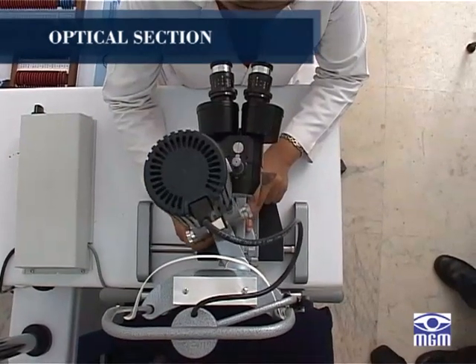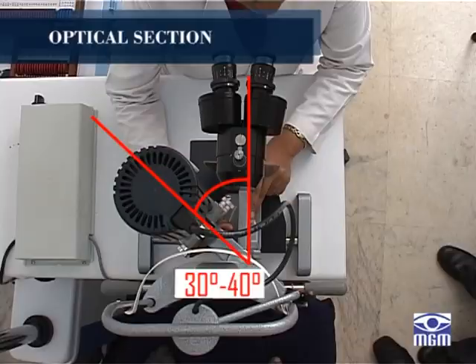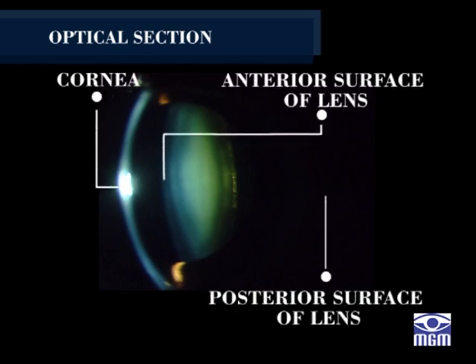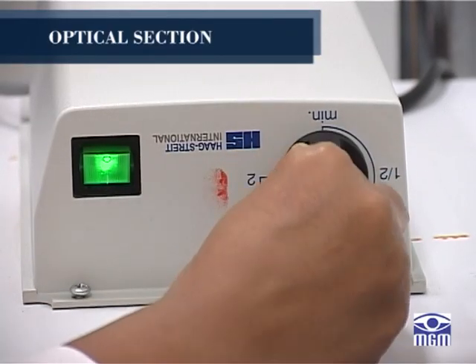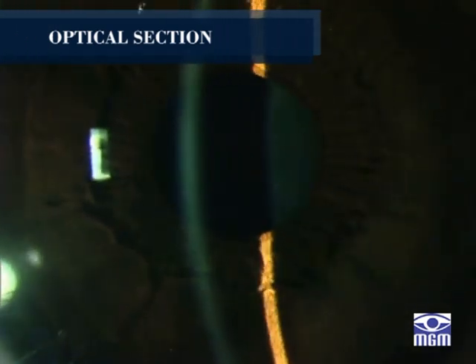Here, the slit beam is projected from an increasingly lateral position. The greater angular presentation has the effect of increasing the distance between the anterior and posterior surfaces of the structure under study. For maximum effectiveness, the light intensity is set to maximum, and the slit beam is diminished in width to a point just before the optic section loses structural integrity.